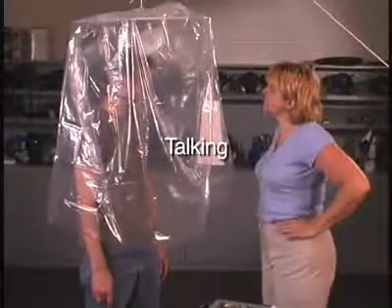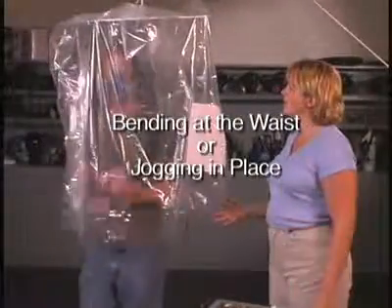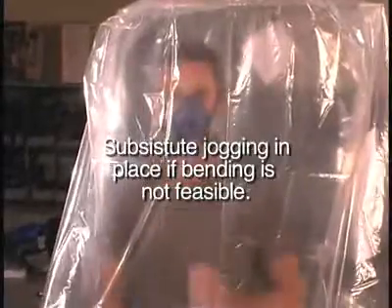Talking. Read the Rainbow Passage. Reading it will cause a wide range of facial movements. Alternative readings that serve the same purpose may also be used. Bending over. Substitute jogging in place if bending at the waist is not feasible.